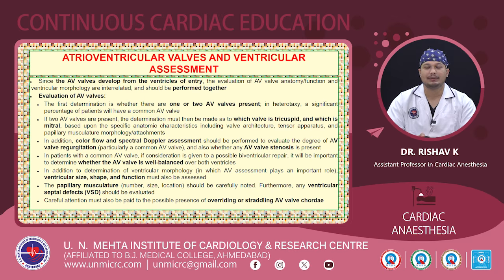We have to determine the presence of any AVVR, that is AV valve regurgitation, especially in case of a common AV valve, and also whether any AV valve stenosis is present. So this will also help us to determine whether a single ventricle palliation or a biventricular repair is feasible. And in patients with a common AV valve, if consideration is given to a possible biventricular repair, it has to be determined whether the AV valve is well balanced over both ventricles.